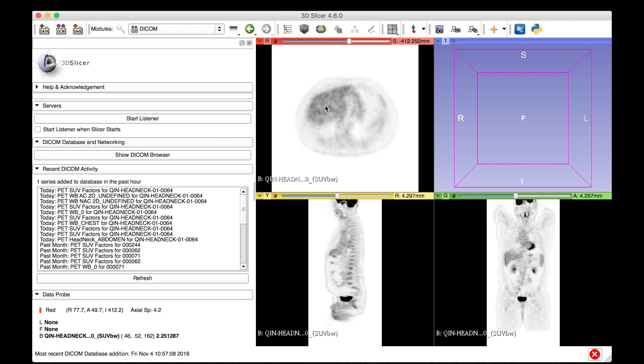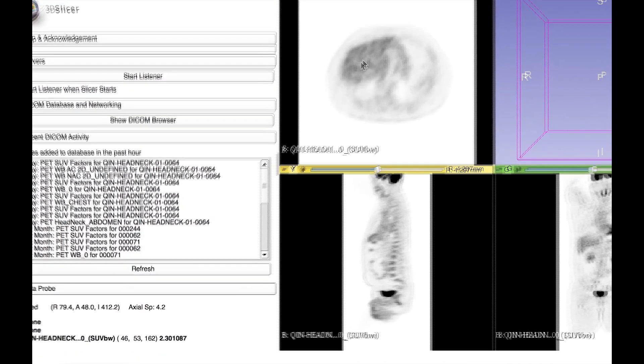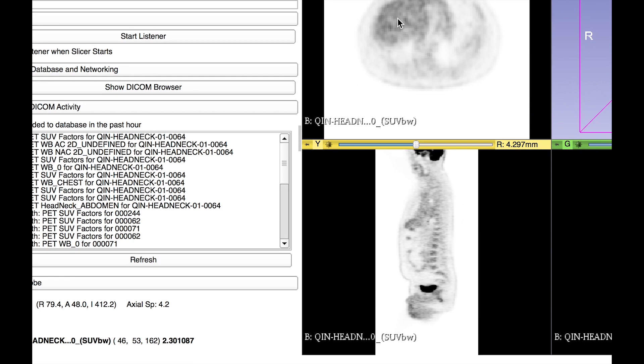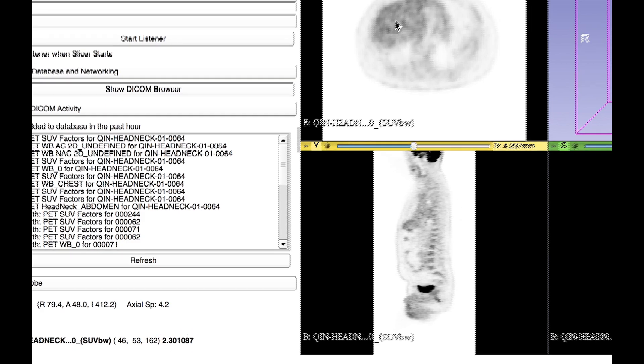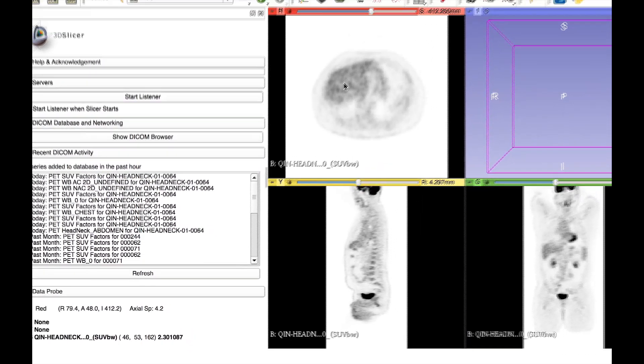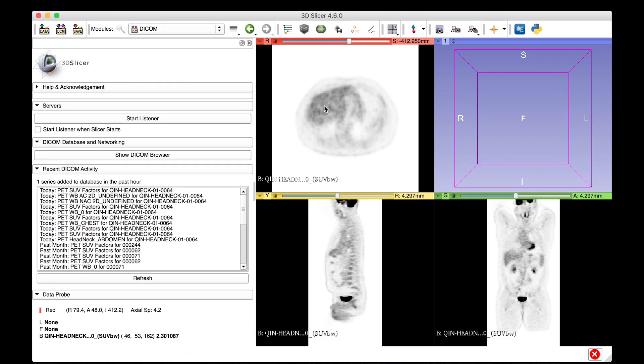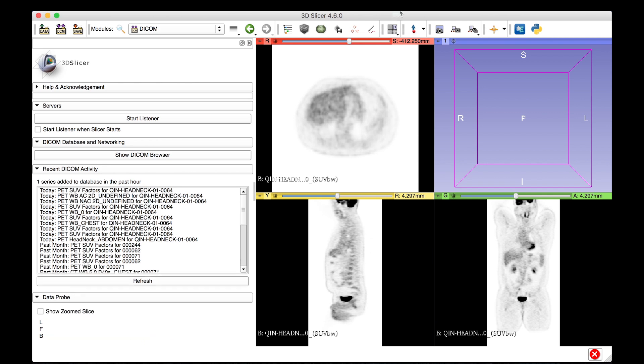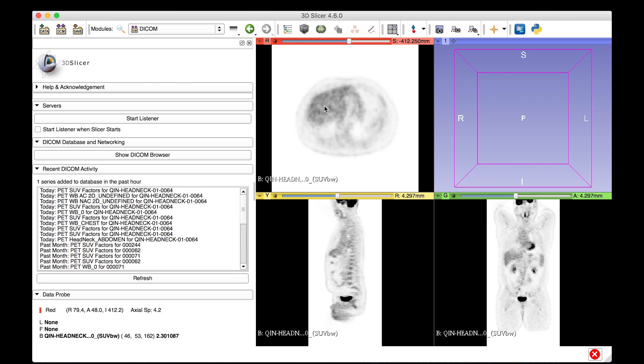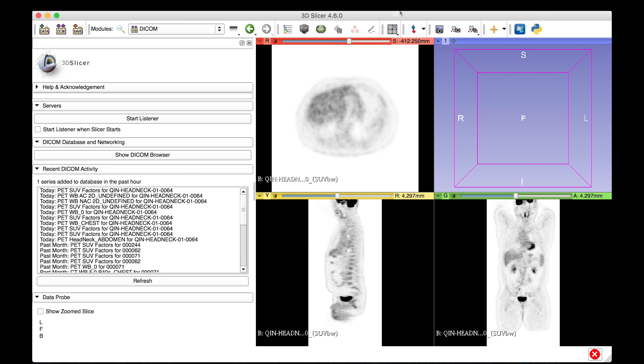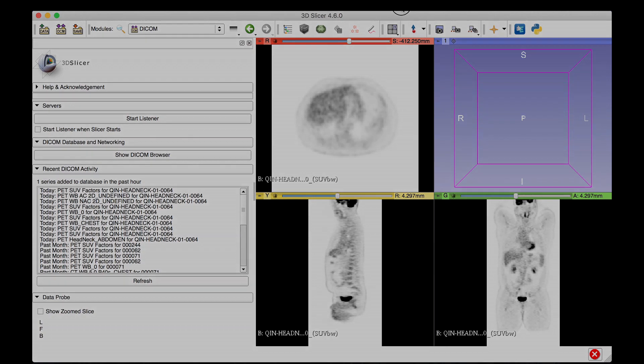To verify SUV normalization, we can navigate to the liver in this FDG18 PET scan and check its uptake values. The liver in this dataset has uptake values in the range of 2 to 2.5 SUV units, which is a typical range for this type of PET tracer. Now that the scan is SUV normalized, the subject may be analyzed using a variety of quantitative tools.